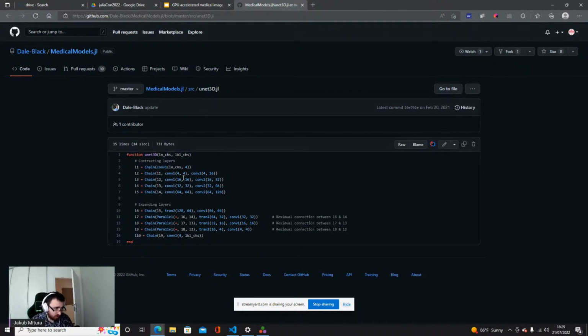Here is the same. Basically, why does the convolutional neural network serve? Because the convolutions are looking into the area around, and on the basis of the area around, they compress this data into a reduced form, let's say.